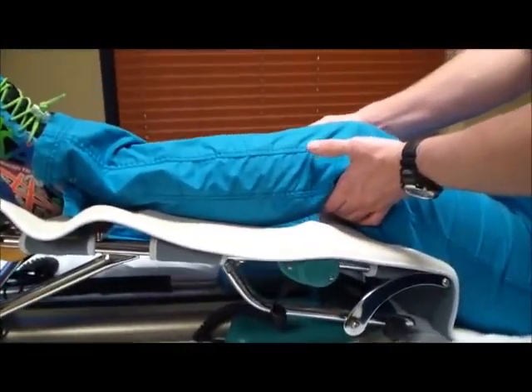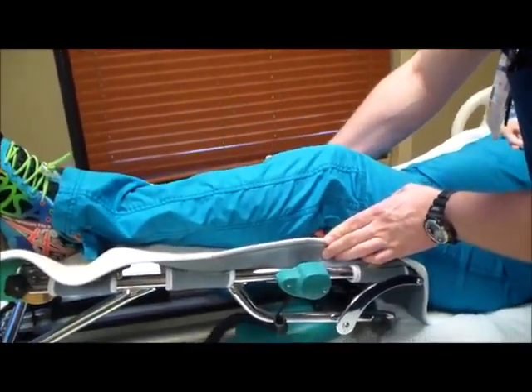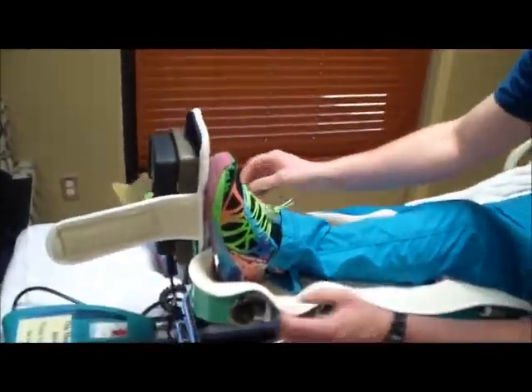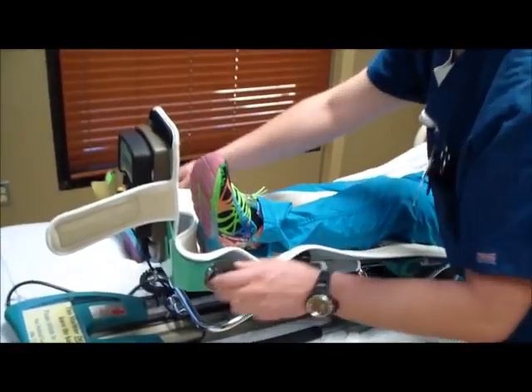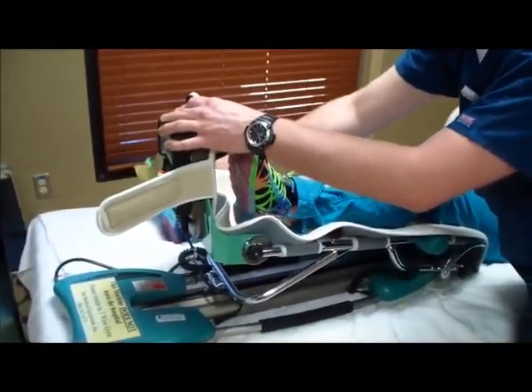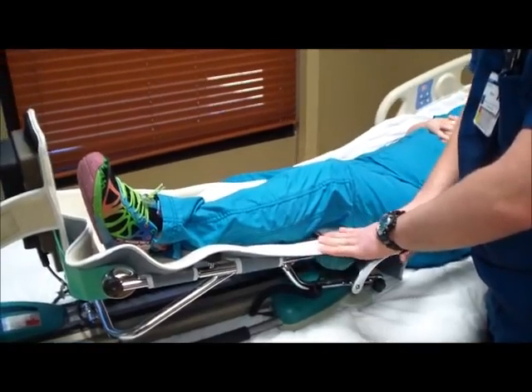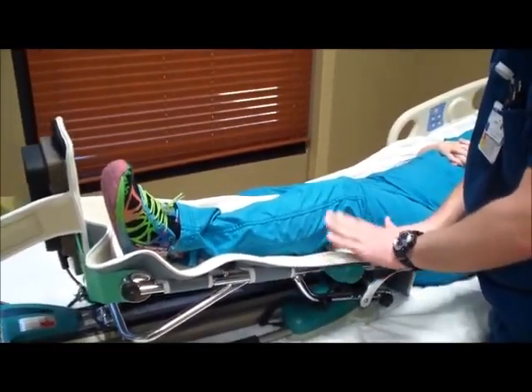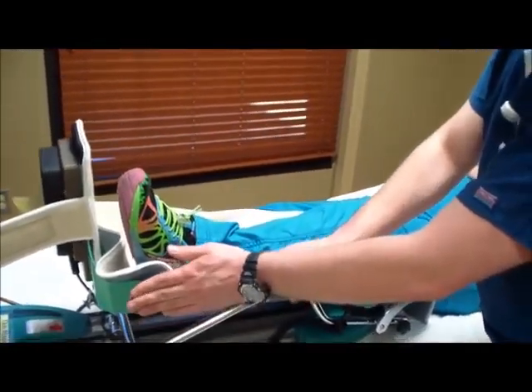So again, underneath the patient's knee, figuring out where that crease develops. And we're still a little bit short, so what we need to do is increase our length here as well. These help adjust the ankle. And you also have ones up here that help either to flatten it or extend other things related to this, which are not primarily used. The primary two that you're going to use are these two here.